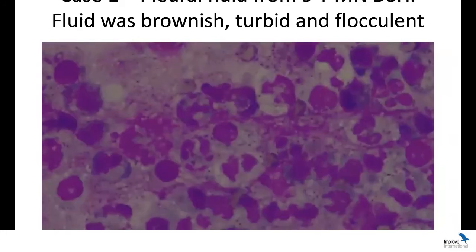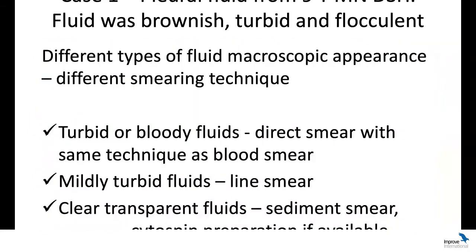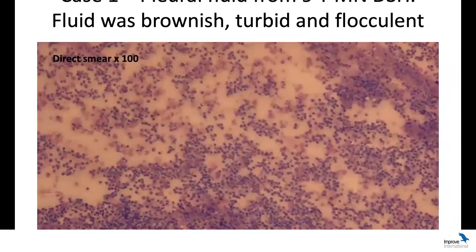So do I have granules? Do I have bugs? Do I have nuclear detail that is important, such as nucleoli and whatnot? So in this case, what we had is really high cellularity smears. So we had lots and lots of cells to look at. And these cells were well distributed, so they weren't all clustered in one place. And often they were well preserved.